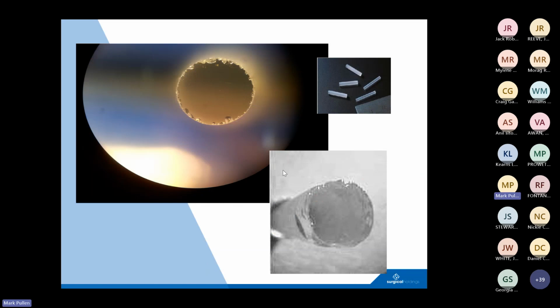So here's another example. We've seen some splintered glass rod lenses. This is actually the top left-hand side here. This is still inside the scope. There is a technique that you can use to train your eye. If you put your eye up to the viewing window of the scope, and slowly draw it away, but keep your eye focused down the shaft, you can actually see the individual rod lenses. If you do it enough, you'll be able to pick up which rod lens is actually broken or cracked.